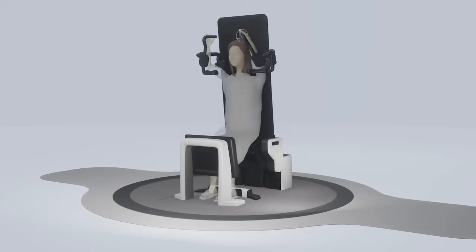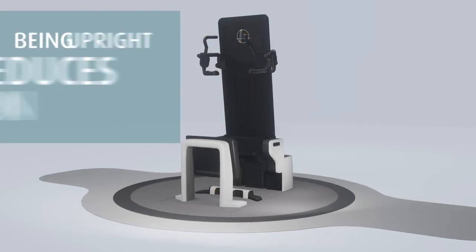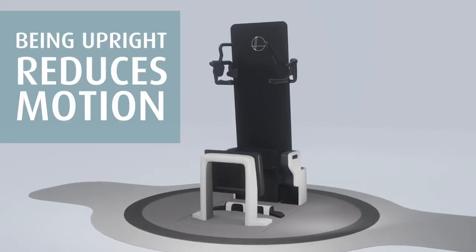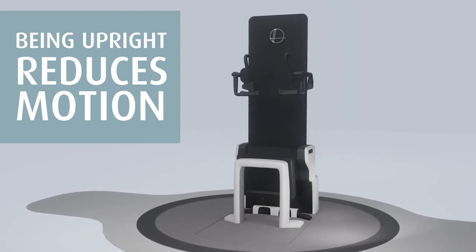Our technology allows gravity to help. After all, the clinical evidence is clear. Being upright reduces motion, meaning better treatment accuracy.